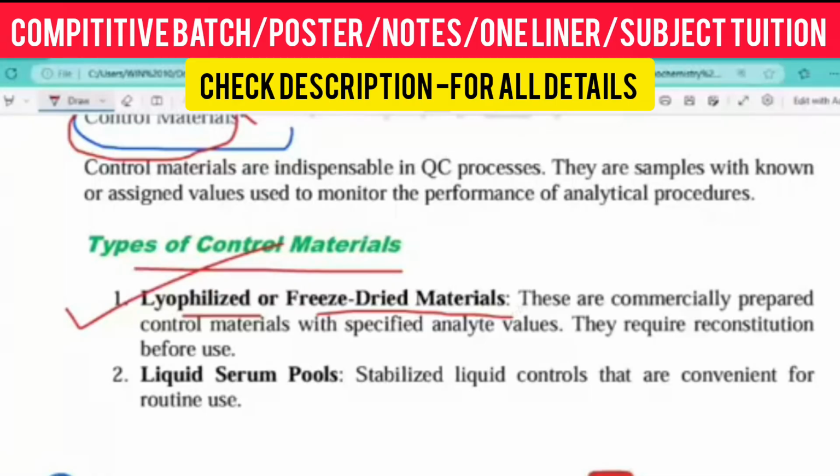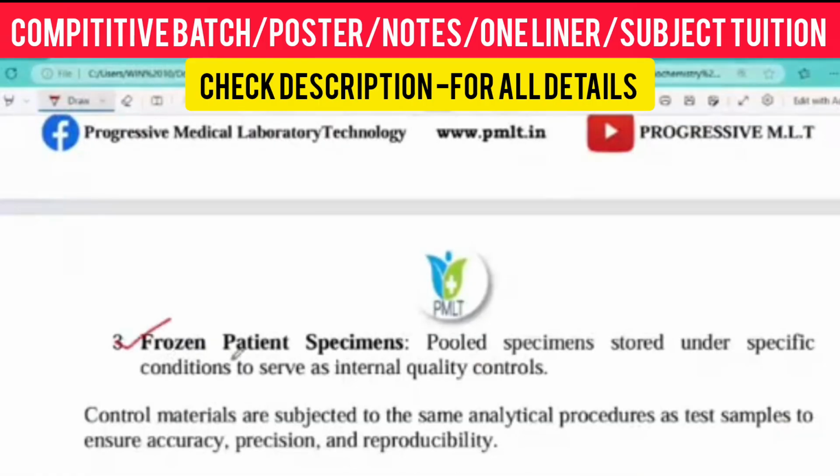Secondly, a liquid serum pool, stabilized liquid control, is also used. You collect some quality serum and create a pool. Whenever quality control is required, you can use this serum. That is the quality serum pool. After that, frozen patient specimens.